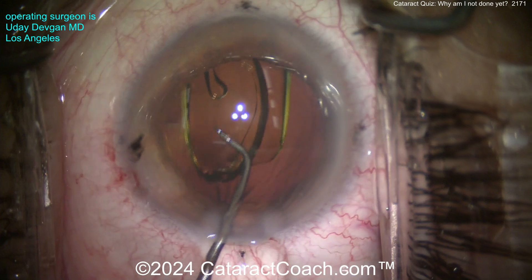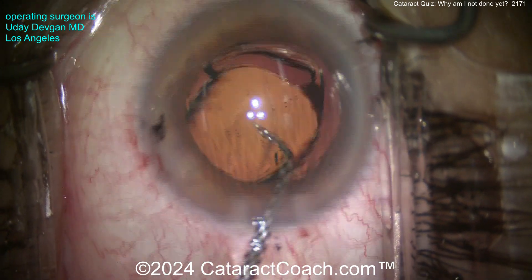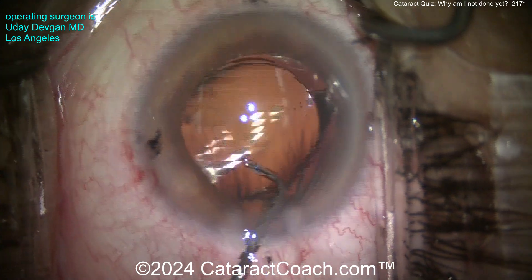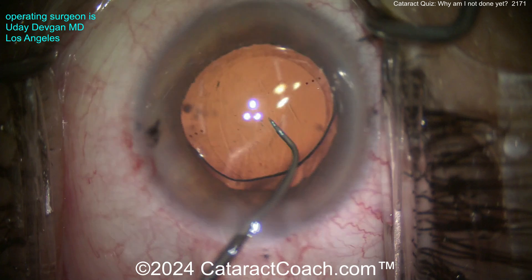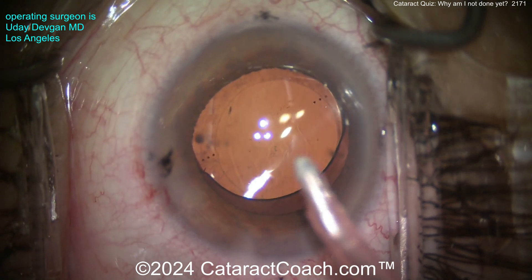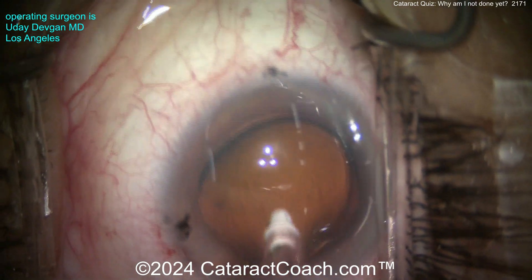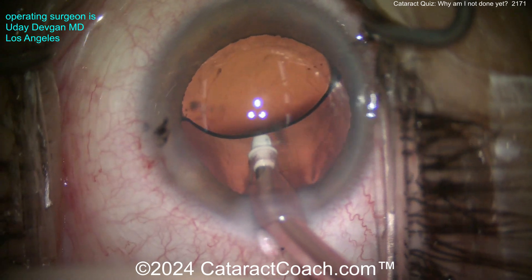Now we'll get this toric lens aligned appropriately at the correct meridian. Remember, the view through our surgical microscope is better than even this HD video. This is a high-def video at 1920 by 1080 pixels, also called 1080p.